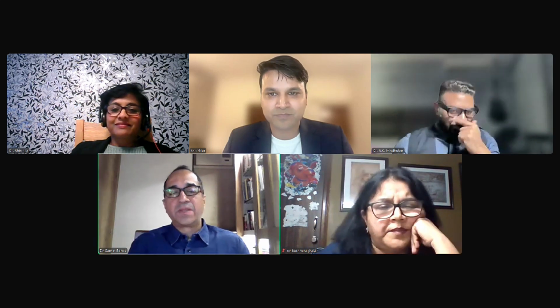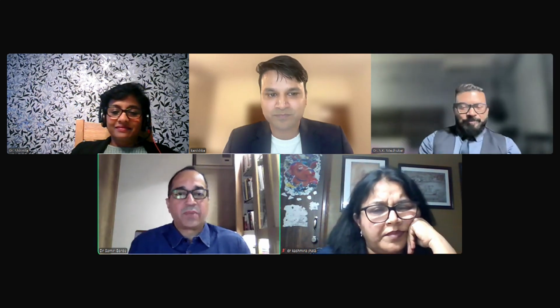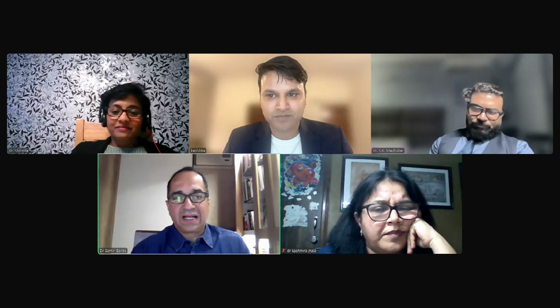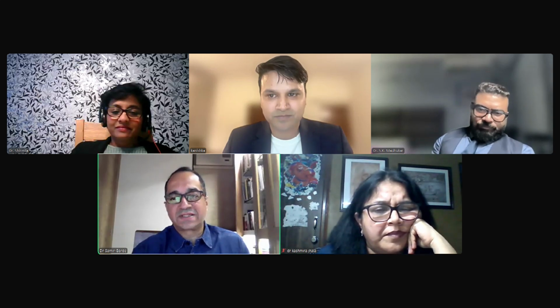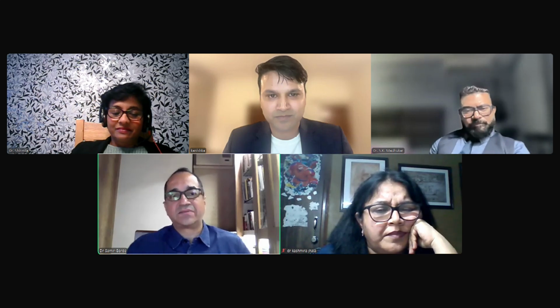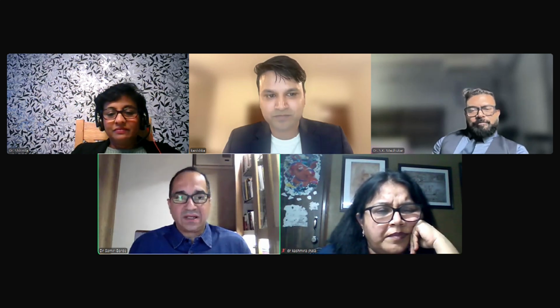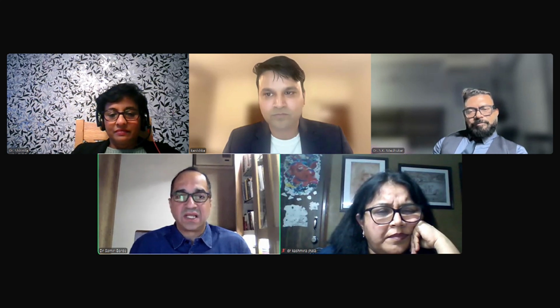Shall I answer? It depends on what time you are seeing the patient, whether the patient has just arrived in ER or ICU or it is 2 hours after your NIV. If the patient has just arrived, and since you are talking about restrictive lung disease, but I take this as a general respiratory failure thing, you should give a couple of hours for the ABG, tachypnea and hemodynamics to settle. But if despite 2 hours of good ventilation this is the condition, then one should go ahead with intubation and ventilation, depending on what the clinical scenario is.